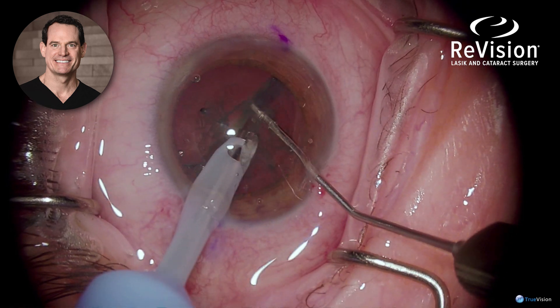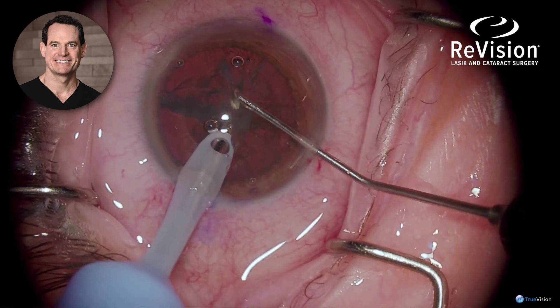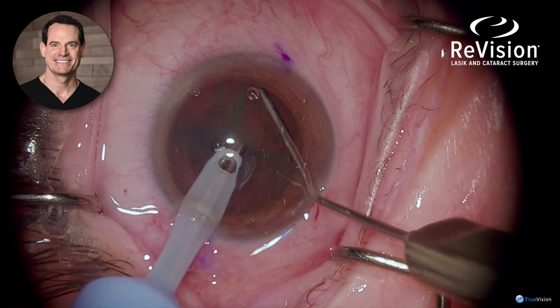The lens is then further divided — even though it's been pre-divided by the laser — using the chopper.